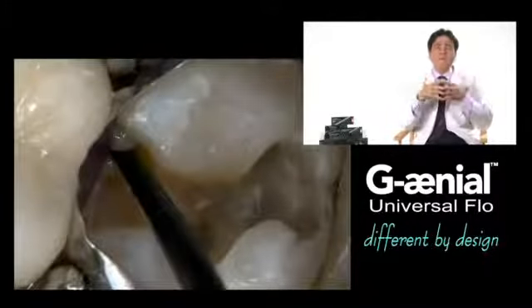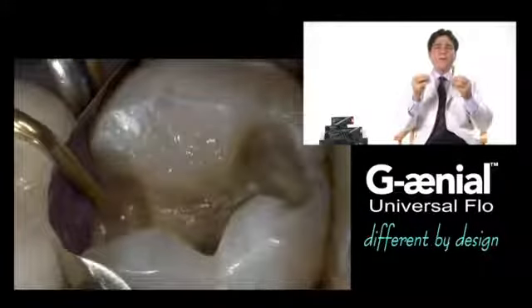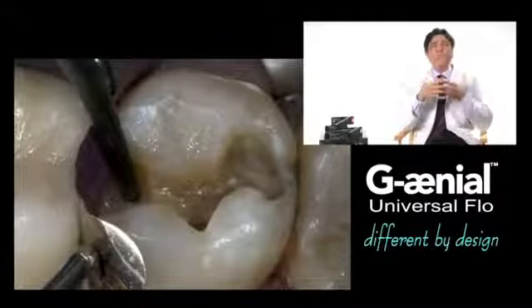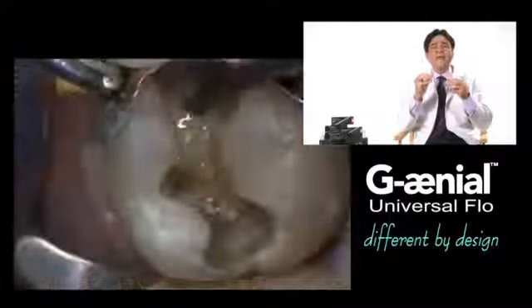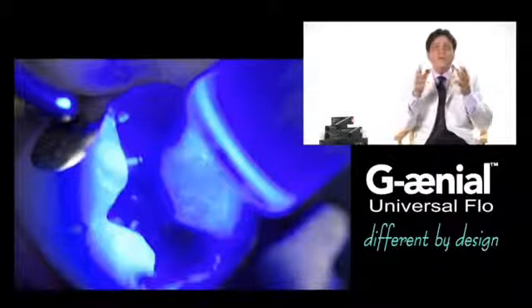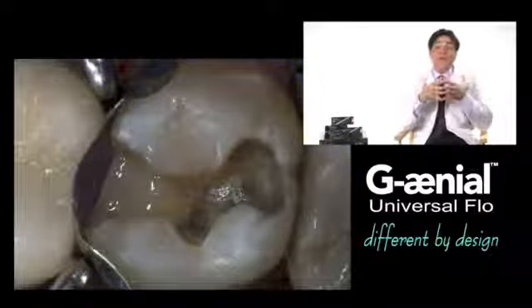and reduced microleakage. Also, the flowable materials may enhance the wetting capacity of the restoration, resulting in a more complete interfacial internal adaptation, reducing void formations, which can contribute to a weakened surface and microleakage.